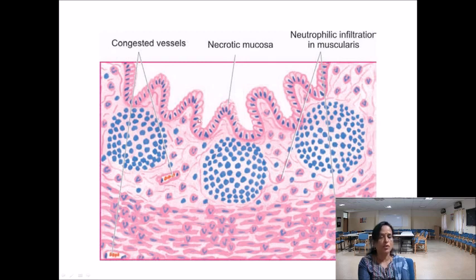The columnar mucosal cells, the neutrophilic infiltration. This is how the neutrophils appear. You have seen them in a blood smear. They're seen as smaller cells in the tissue sections. They do show nuclear segmentation. They all look like ants. See? Let us see that.